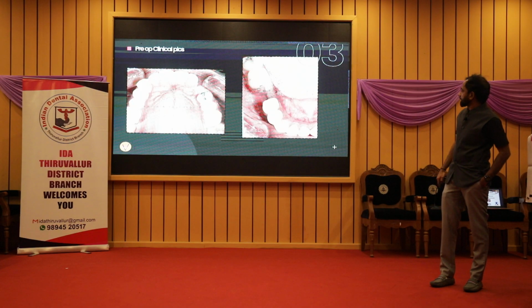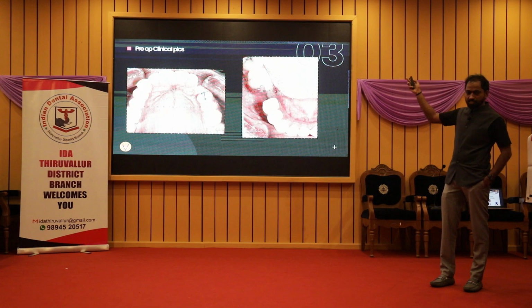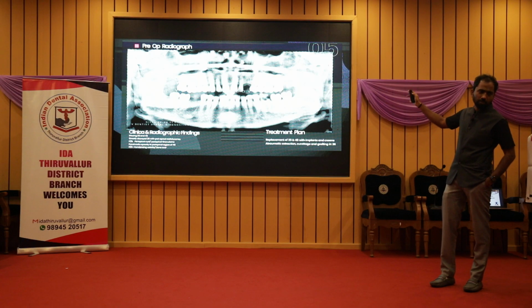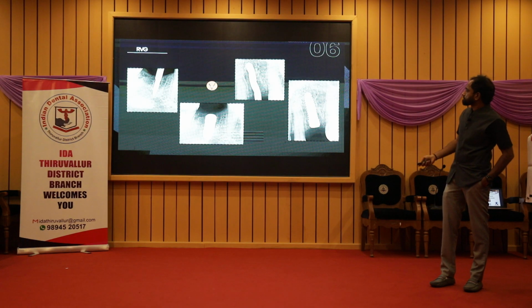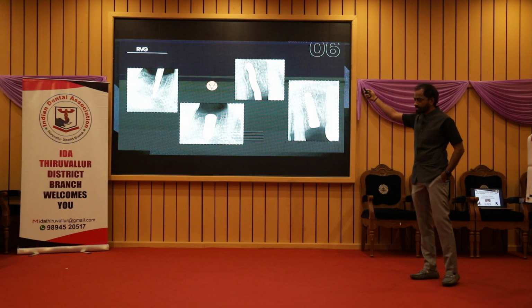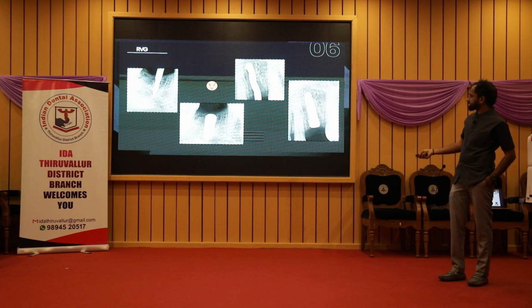And that is the edentulous area. Patient also had, this is from another presentation, also had missing teeth in the lower. And that was the OPG. You have a little bit of crestal loss, maybe ST1 or ST2, and you can see the upper one, that is a drill, and that's the implant placement.